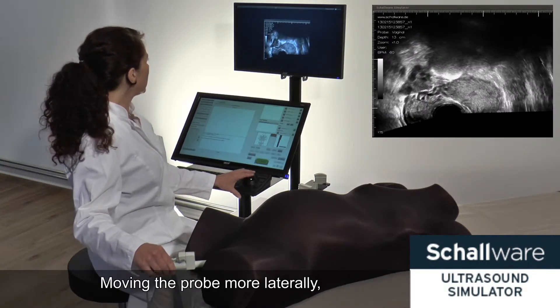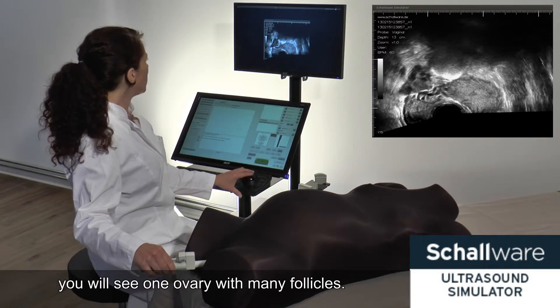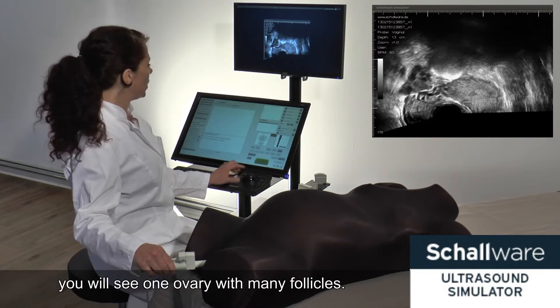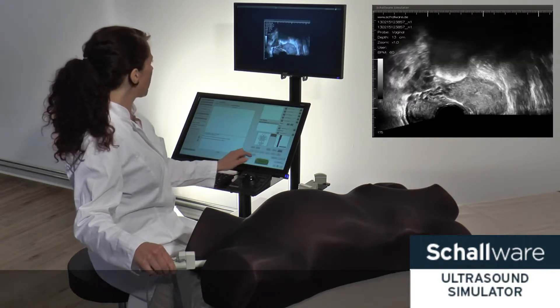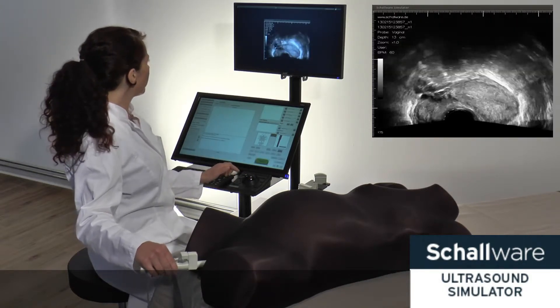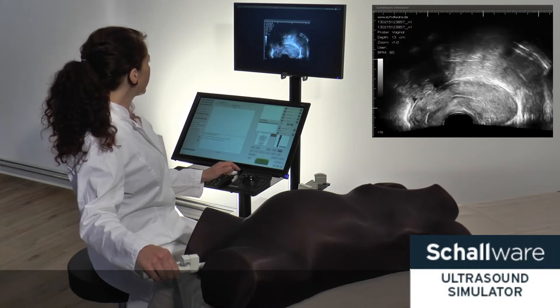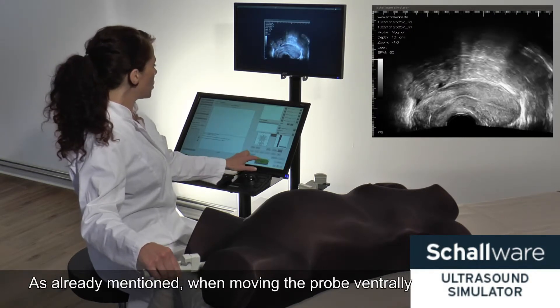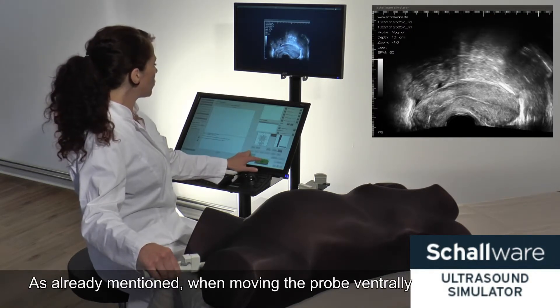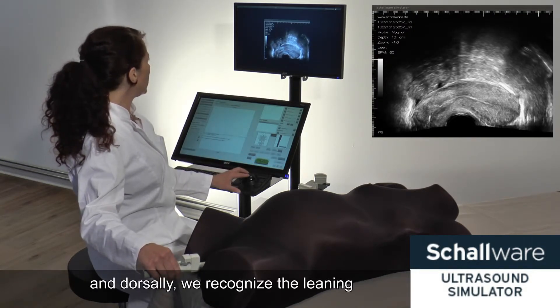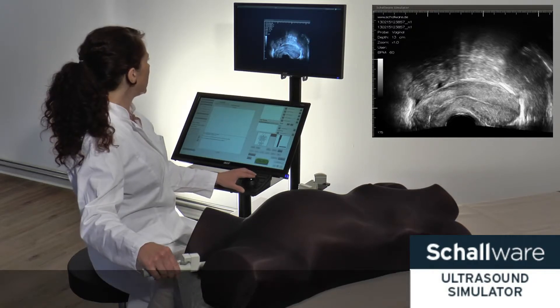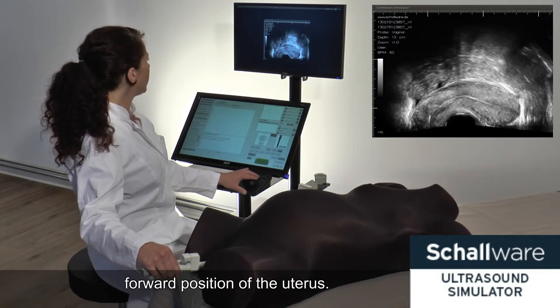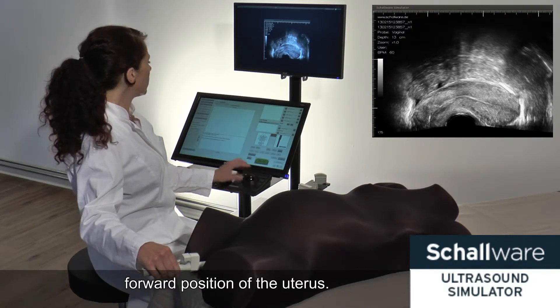Moving the probe more laterally, you will see one ovary with many follicles. When moving the probe ventrally and dorsally, we recognize the leaning forward position of the uterus.